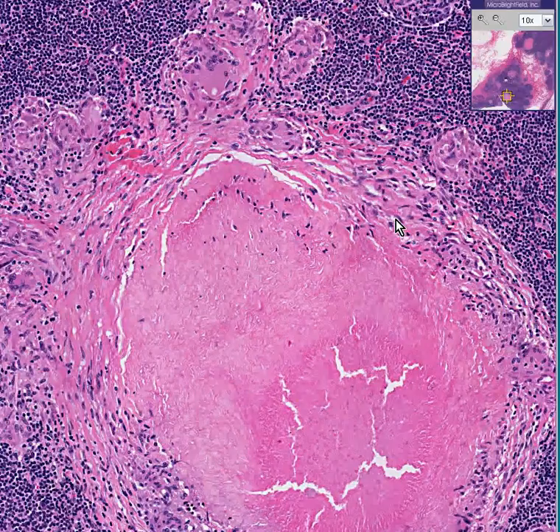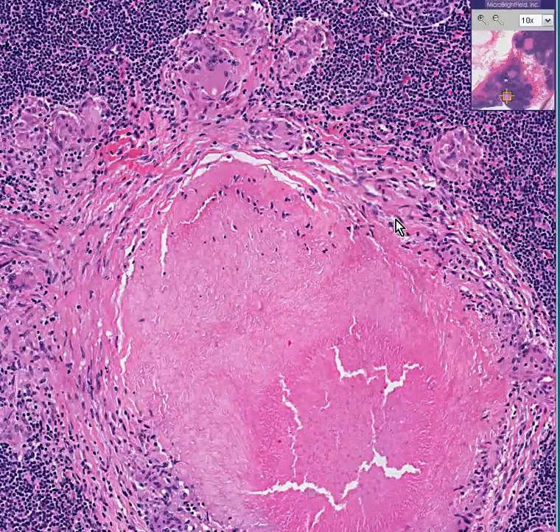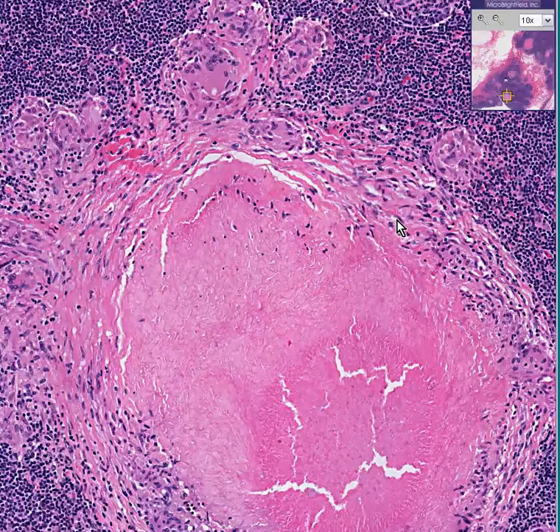Once again, caseating granulomas of tuberculosis within a lymph node. Thank you very much.